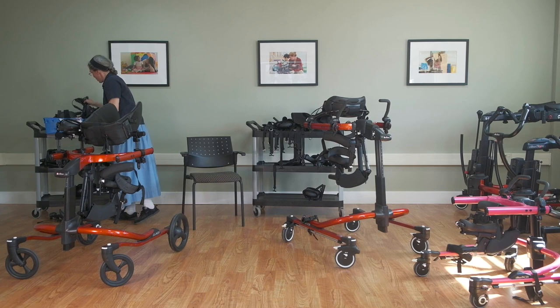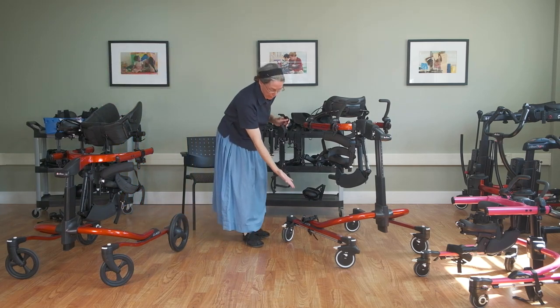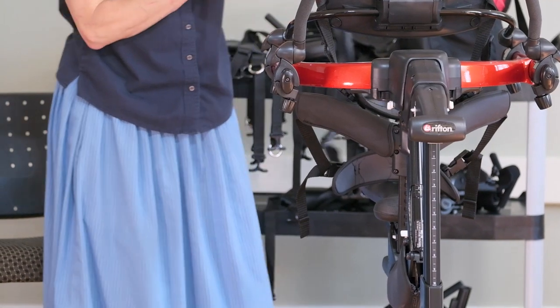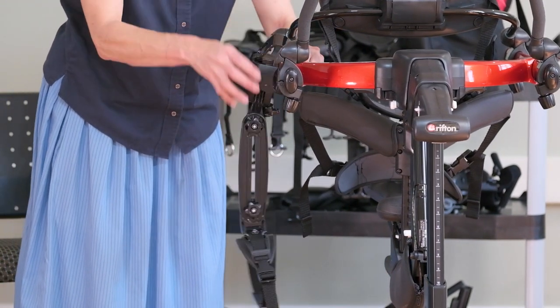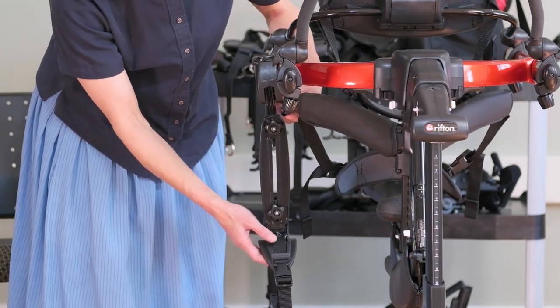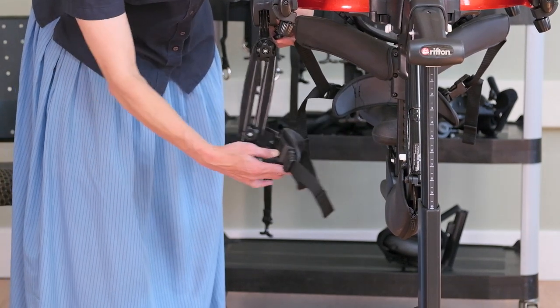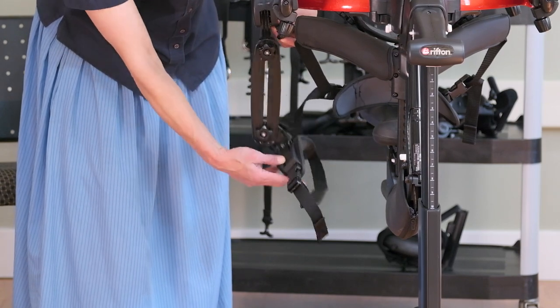There's also the thigh prompt. Both the ankle prompt and the thigh prompt can help prevent scissoring. The thigh prompt does not have a right or left — you can put it on either side and on the inside or outside of the frame. Once secured, you use these knobs to adjust for height and for the amount of abduction/adduction, and then it can swing freely at the side of the student.